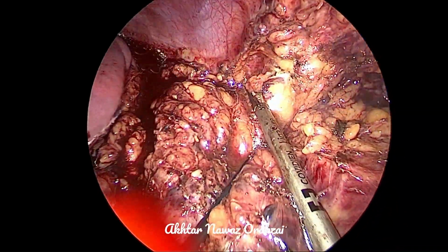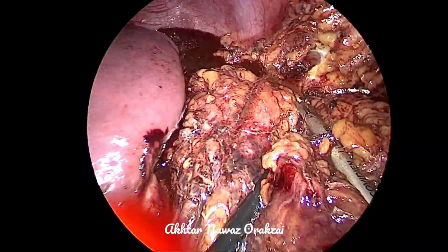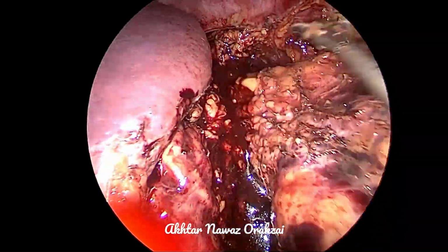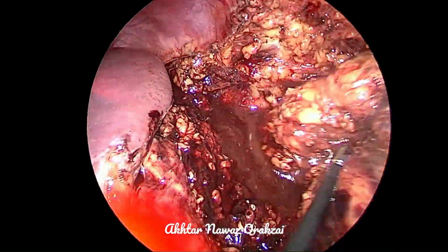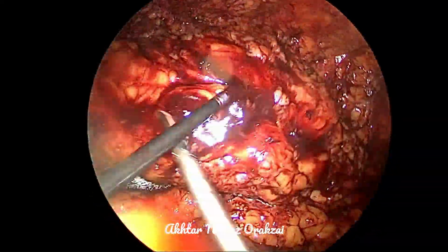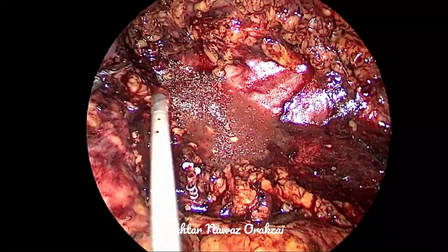So here the diaphragm needs to be saved. This area is really badly stuck to the kidney. So if we go a little lateral or away from the kidney, the diaphragm fibers may easily be opened. So once there is a chance of this, we pull the kidney medially and we dissect as close to the kidney as possible, and hence the injury is prevented.